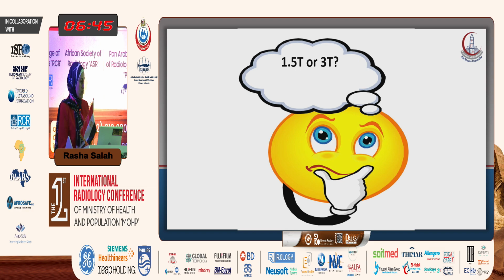Let's ask a question: when to do the multiparametric MRI, on 1.5T or 3T? Actually, 3T is better for evaluation of the multiparametric MRI, and the guidelines recommend 3T imaging for the prostate. However, there are some indications where 1.5T could be of value, especially if the patient has a prosthesis in the hips, which will hinder the image evaluation due to the artifact induced at 3T.